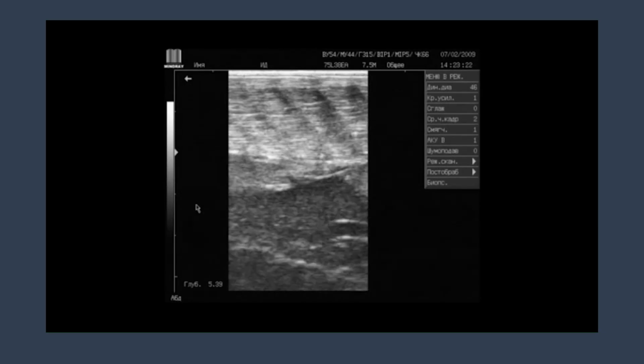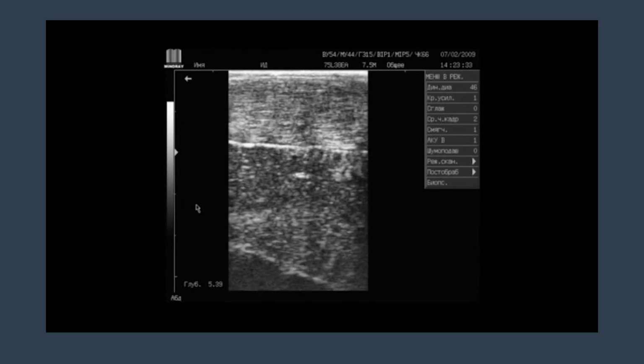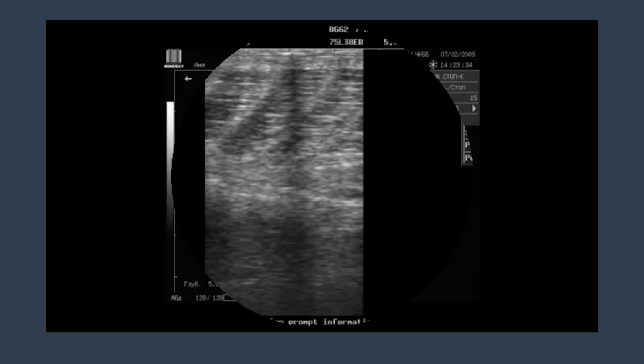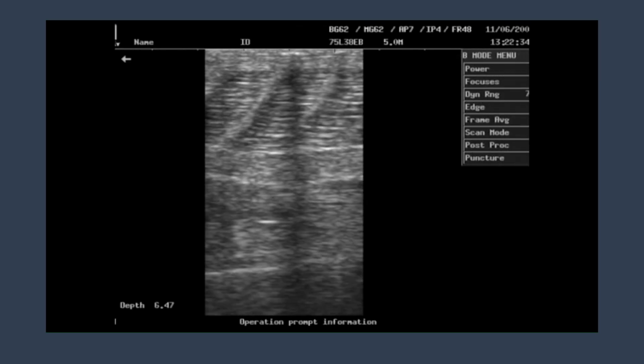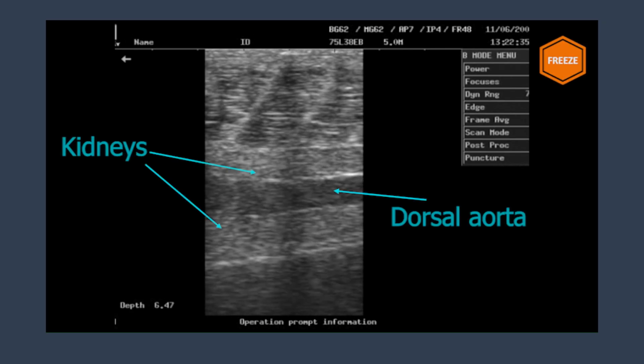In large fish, the kidneys on the sonogram may have an even greater resemblance to the male gonads or fish with gonads at the beginning of the second stage of maturity. The main distinguishing feature of kidneys in this case are large blood vessels, which we cannot observe during the study of the gonad margin when the transducer is properly placed. In the kidneys, these vessels are clearly visible. They can be either the cardinal vein or, as in this case, the dorsal aorta. When the transducer is stopped in such a location, the blood flow will be clearly visible, as we've seen in previous videos.